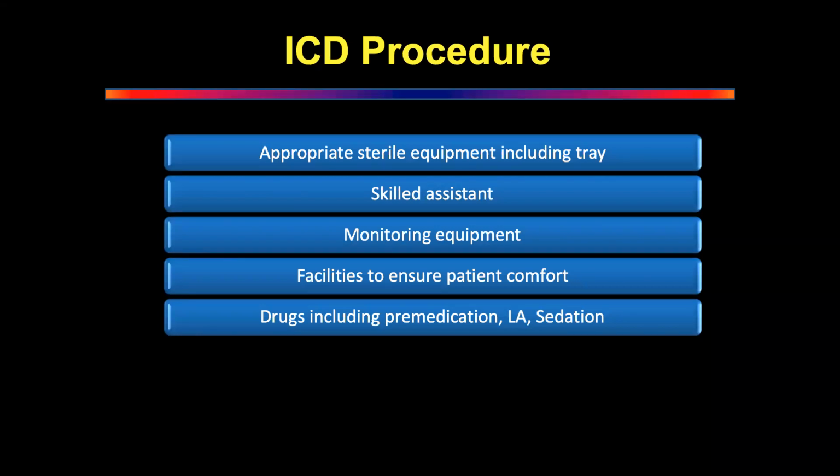Even for adults, this is all for all patients. This is basic for all patients. What else you have to make sure? Oxygen. What does the monitoring guidelines say? What is the one thing you have to use?